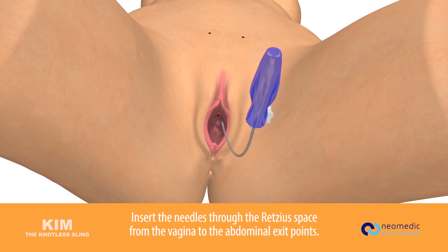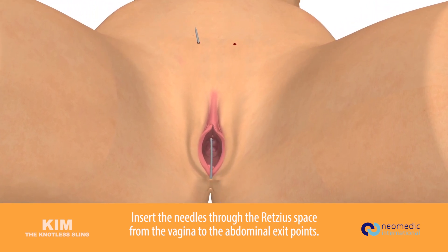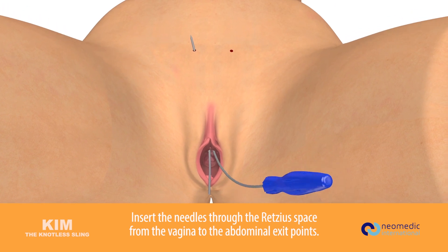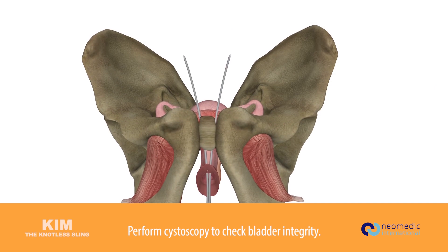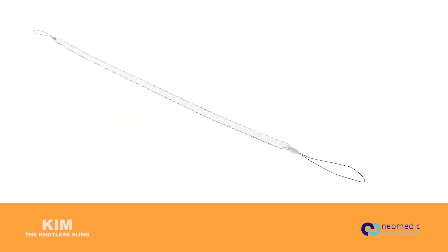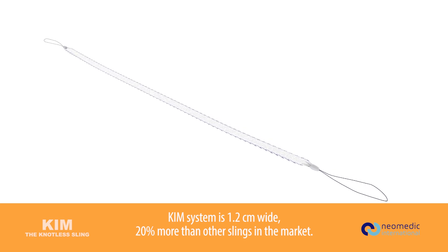Insert the needles through the Retzius space from the vagina to the abdominal exit points. Remove the handle from the needle. Check the bladder integrity by means of a cystoscopy.